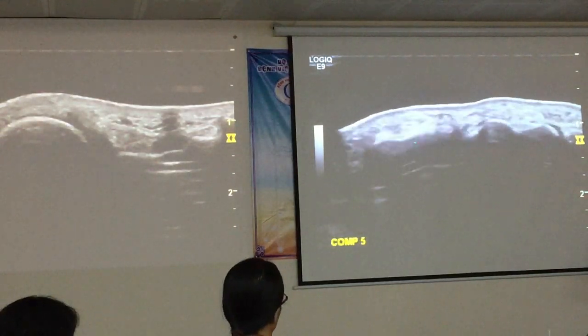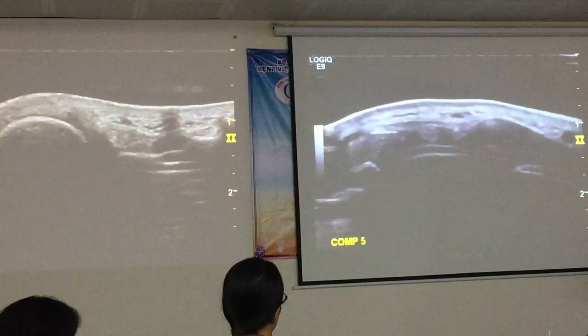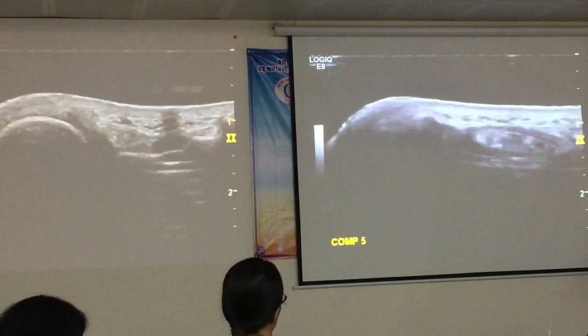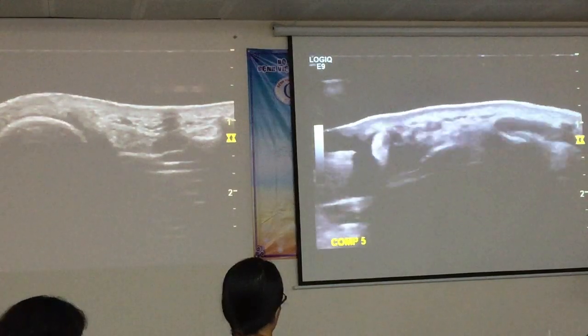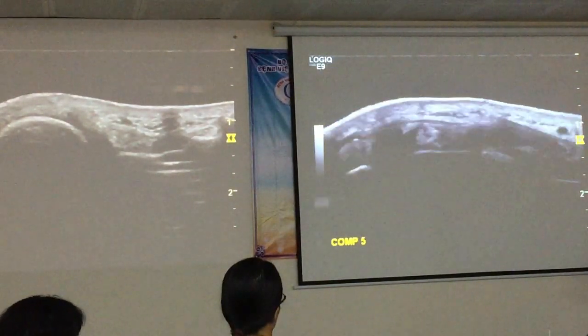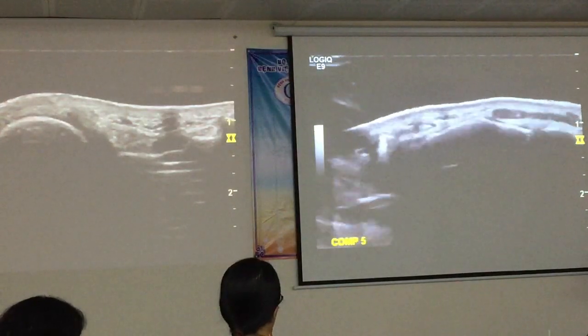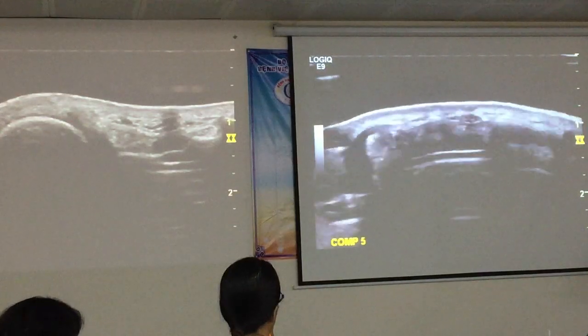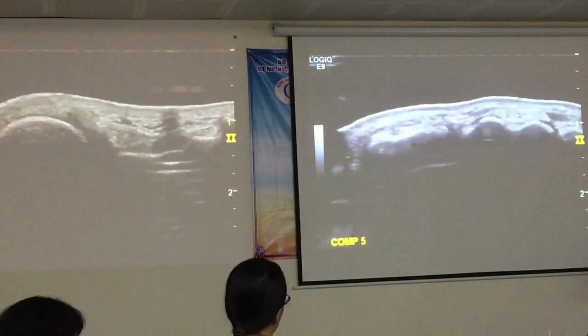So as you can see, these tendons are very small, and we need to use dynamic scanning just to try and familiarise ourselves with that anatomy. A dynamic image is much easier to diagnose than a static image. Mình dùng cái nghiệm pháp động để đánh giá được cái gân cơ đó là thuộc cái ngăn nào, chi phối cái vị trí nào.